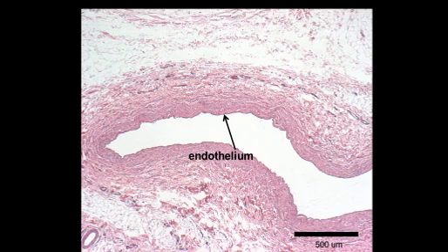If we now look at a histological section, and I wanted to go over this because we're going to look now at different sections of the catheters, controlled and tested. Here in the histological section, what you look for, if you notice very closely, is that the surface here is lined with a series of black dots. Those black dots are the nuclei of the endothelial layer.